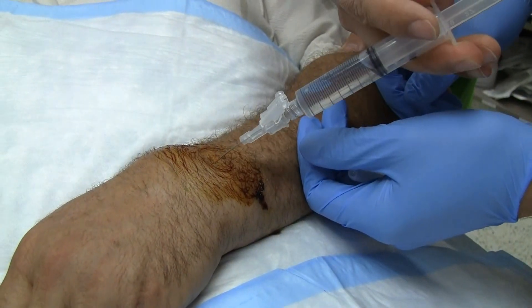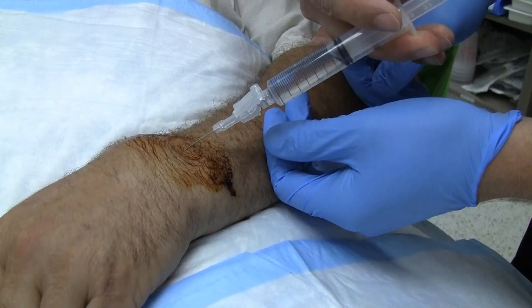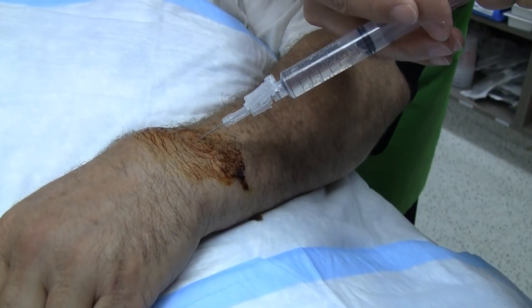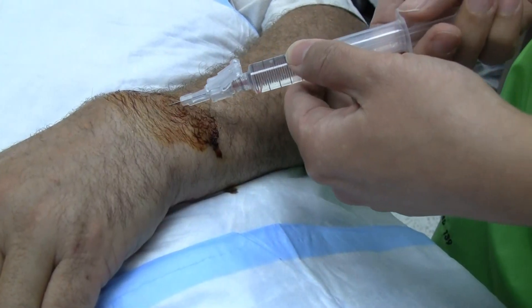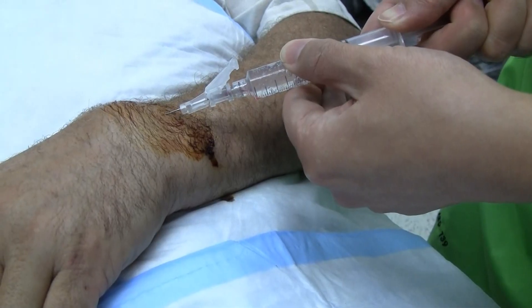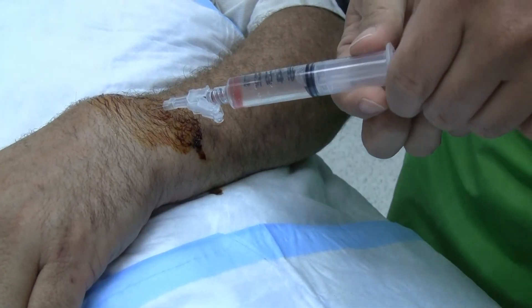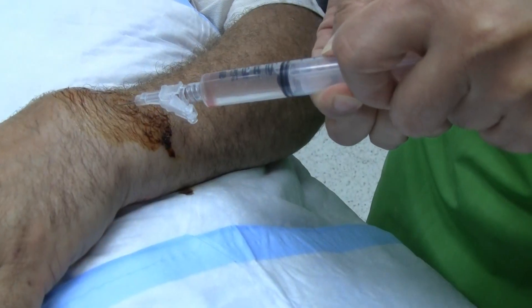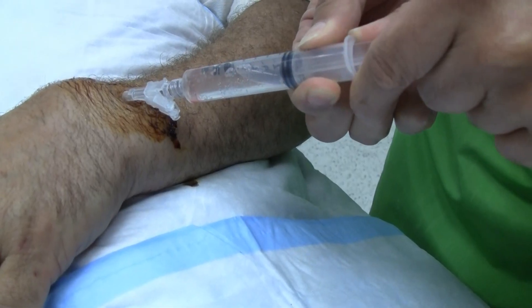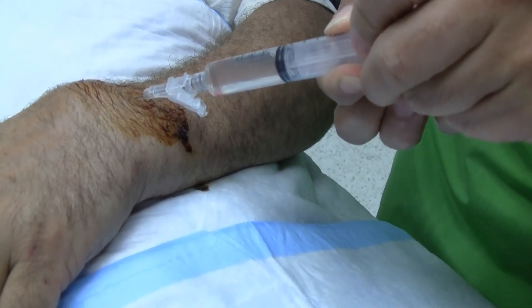When do you decide to do a hematoma block and when don't you? On the distal radius fracture we pretty much always do a hematoma block. How do you decide where to put the needle? You find the fracture site — it's right at the deformity site. I can see a little blood coming back, so you aspirate and push in and out. The needle right now is deep into the fracture.